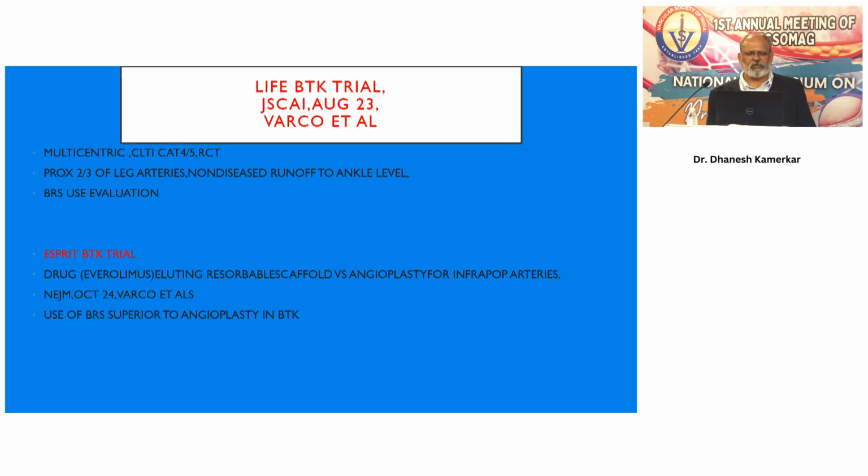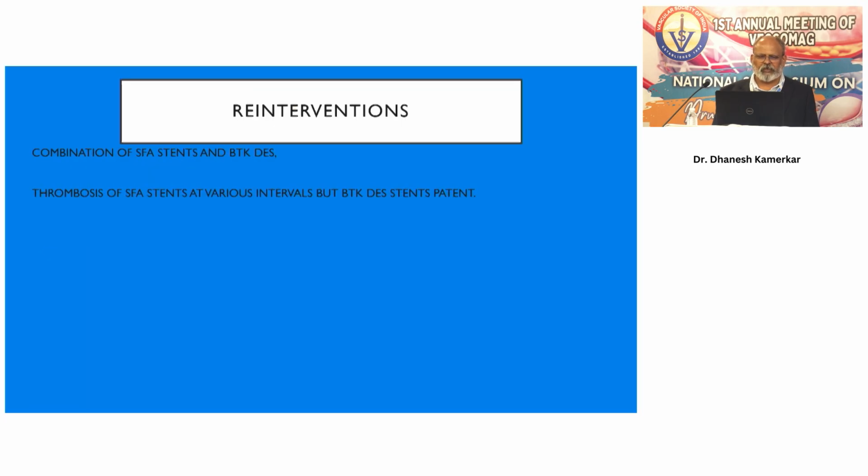These were essentially to evaluate the use of bioresorbable scaffolds, and then it was converted to the ESPRIT BTK trial, an everolimus-eluting resorbable scaffold versus angioplasty for infrapopliteal arteries, published in October 2024 in NEJM, which found the scaffold superior to angioplasty in BTK arteries.